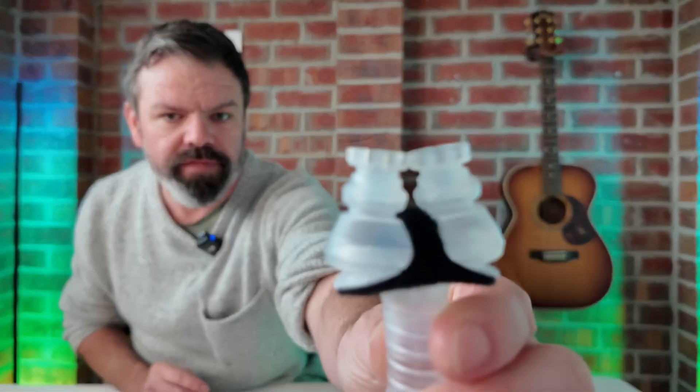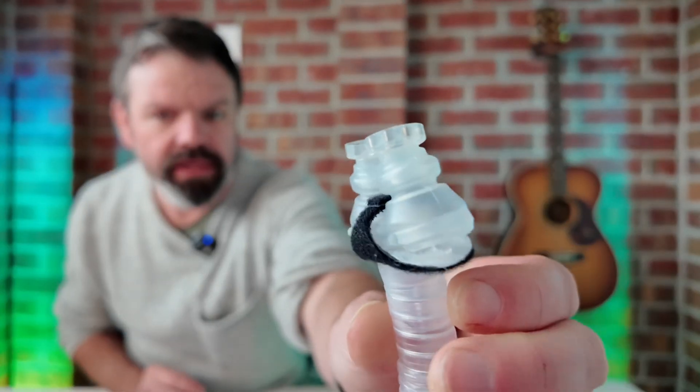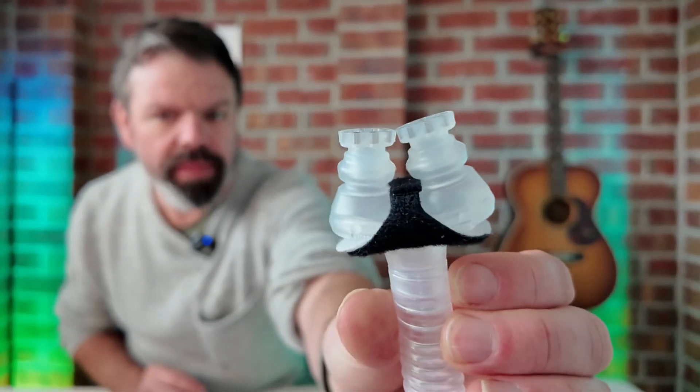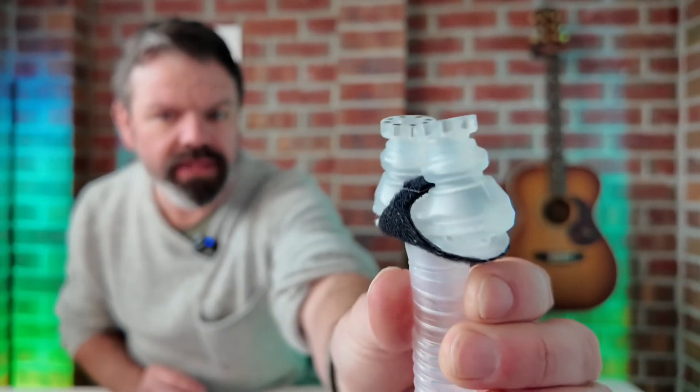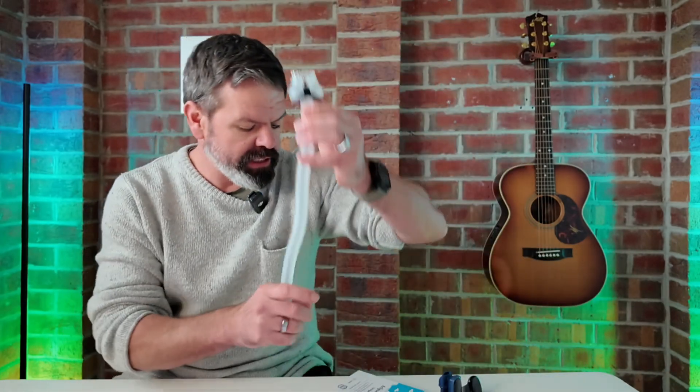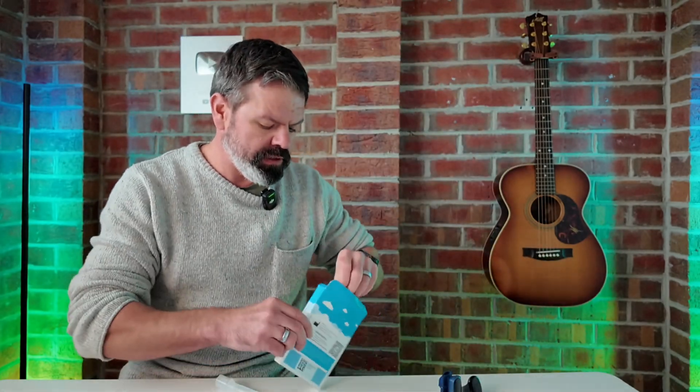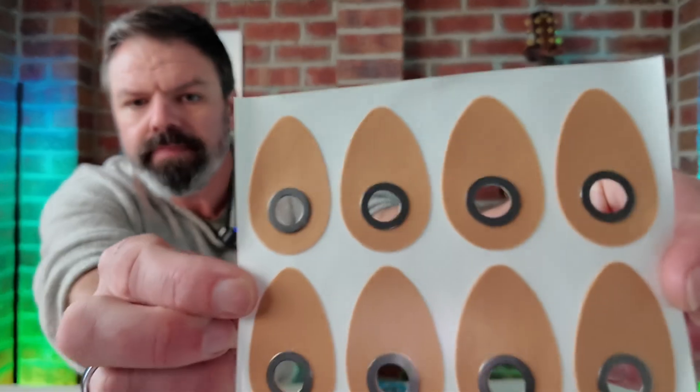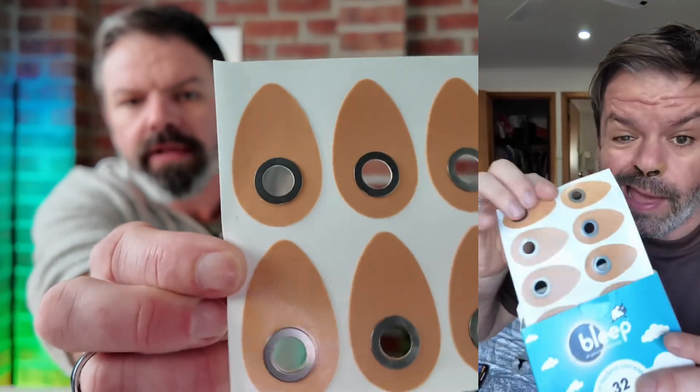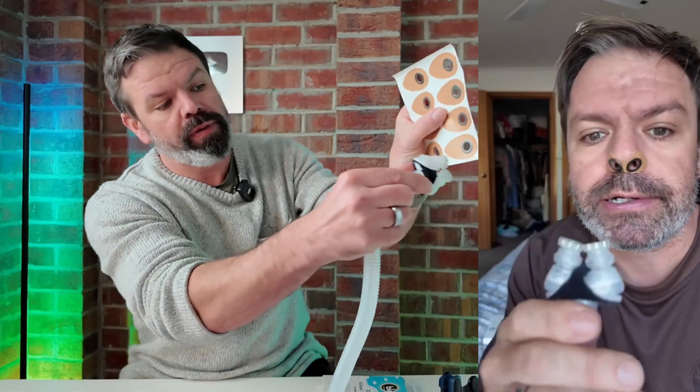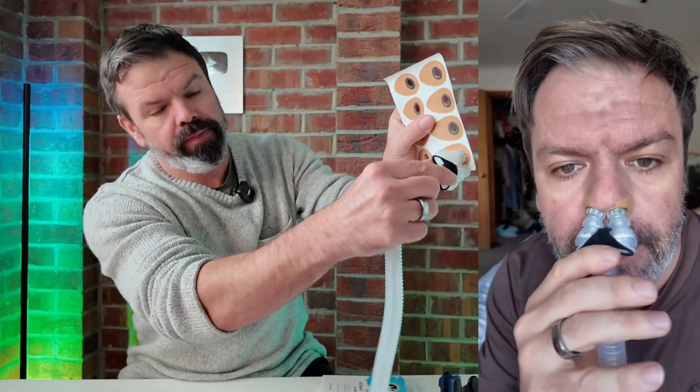It's a very unique CPAP mask in that it has no physical straps. We just attach these little stickers called halos. There's the halos. Just put them up under our nostrils, and then the Bleep Eclipse frame just snaps onto the little magnetic part there.